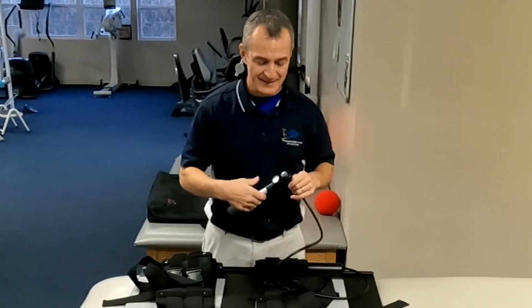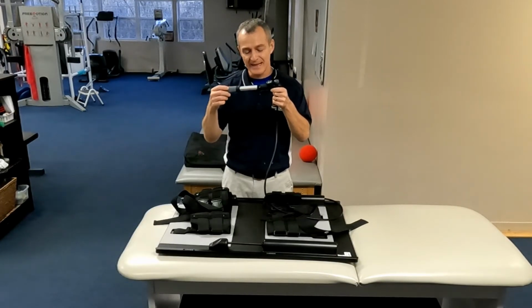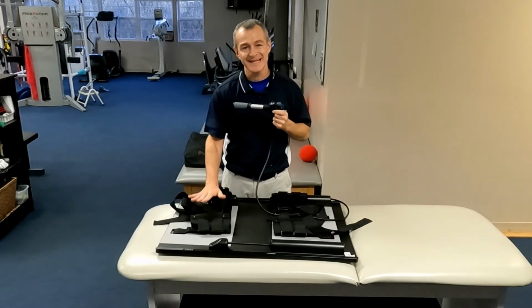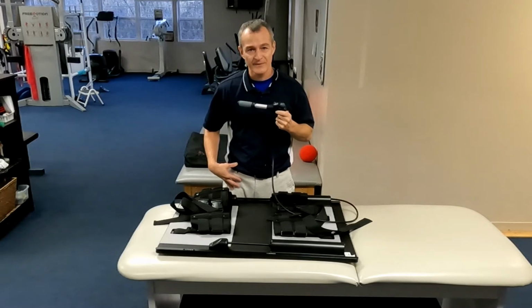And so as I pump the device, whether I pull out or I push in, you can see how the lower segment will start to slide away from the upper segment. The upper segment stays stationary. This is simply providing that traction force to the lower portion of the body.